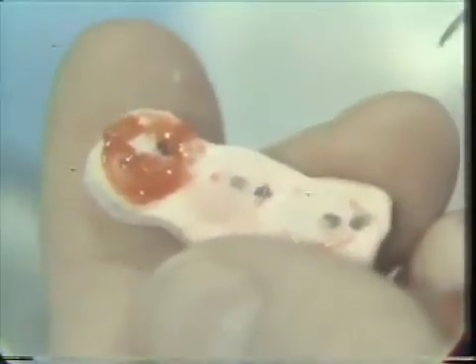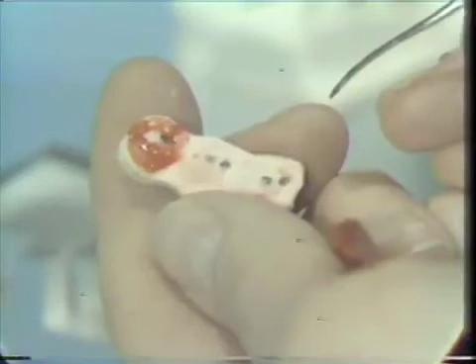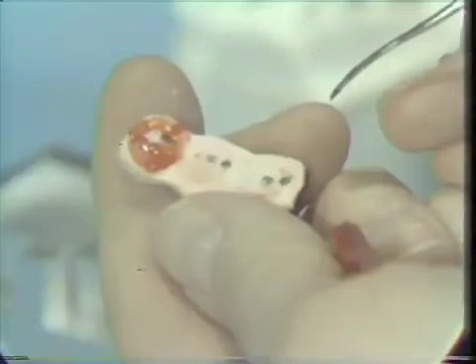Now we'll continue on laying our wax around the periphery of where the teeth are until we've built up a sufficient amount, and then we will transfer that back into the patient's mouth, and we will be ready to do our functionally generated registration.